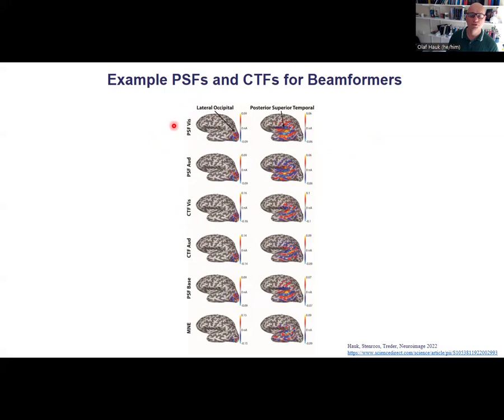So not just on the noise from baseline measures, but they actually use the data covariance matrix to localize sources. So you're basically going around, it's a bit like a dipole scan, where at every location you check how much the forward solution of a dipole projects on the measured data. It's a bit more complicated than that, but that's more or less what they are doing.